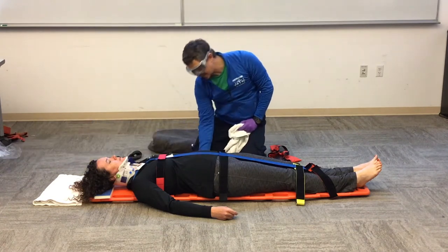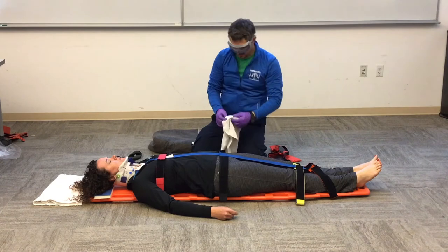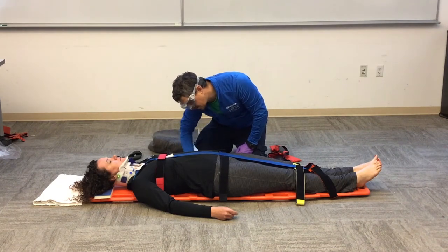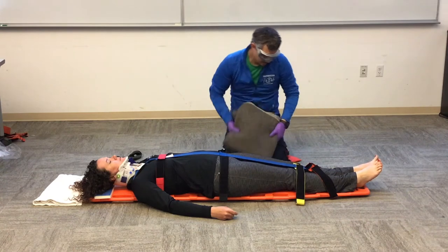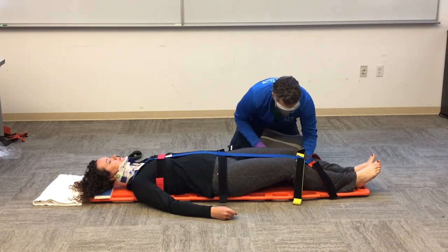I'll use my hand to feel underneath the small of her back. I've got a little bit of padding to put in there that I can feed under to give her a little bit of padding. And then I can give a little bit of padding underneath her knees.